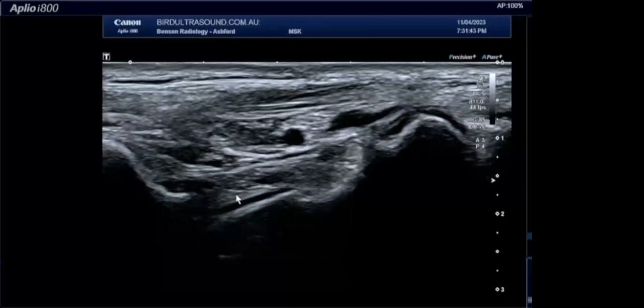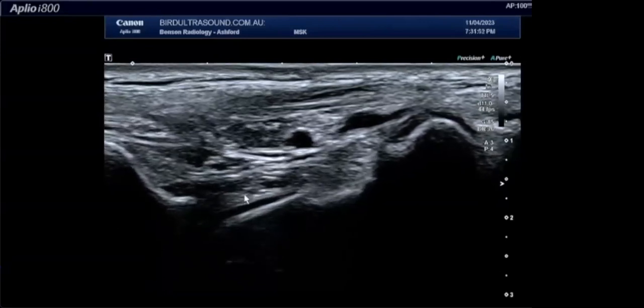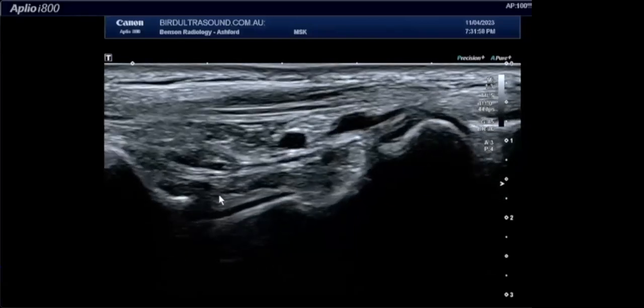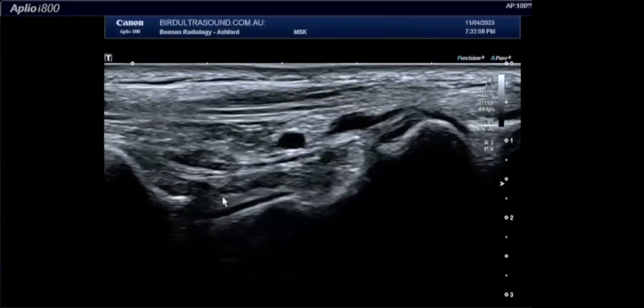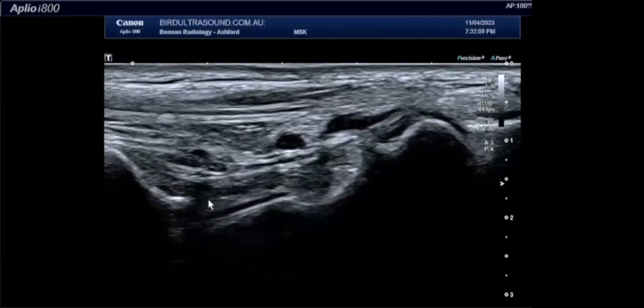What I'm really looking for mainly, though, is the presence of a large effusion. When we have a large effusion, the joint capsule actually hugs this hyaline cartilage, sits right down on top of it here, and that will be displaced anteriorly along with this anterior fat pad. And so you get a fluid collection in this location. And of course, with an inversion injury, if someone's had ankle trauma, not only am I looking for the presence of an effusion, but I'm also considering the concept of seeing a hemarthrosis, or even worse, a lipohemarthrosis.